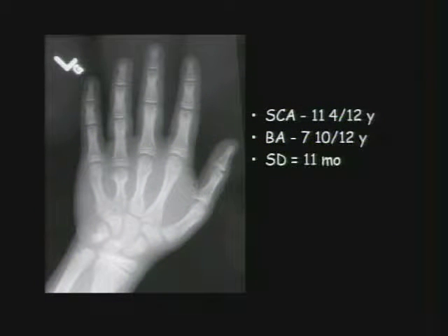Next case is an 11-year-old girl with short stature. I know you guys hate the idea of skeletal dysplasias, but they are more common than cardiac disease in the pediatric population. Make sure you know the name Taybi for the book. If you don't know what a dysplasia is, then you could say, well, here's where I'm going to go look to try to figure out what it is. And he has the classic Bible on skeletal dysplasias.